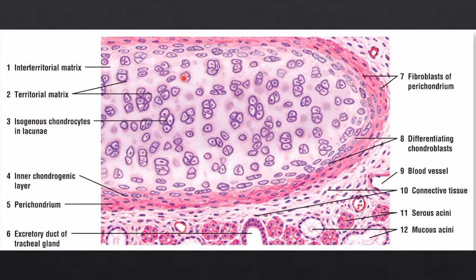This basophilic matrix appears blue in color, and these are called chondrocytes. They are called cartilage cells. They look like eyes. When you are looking into the microscope, they just appear like eyes, looking at your eye. That is an easy identification of hyaline cartilage, the chondrocytes.